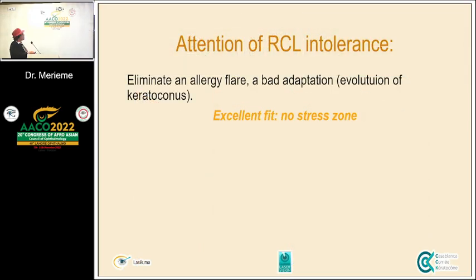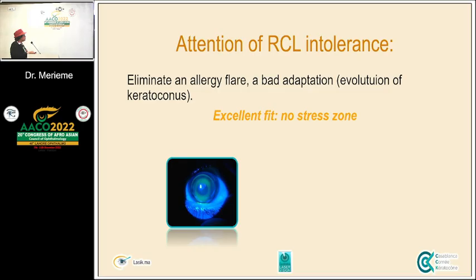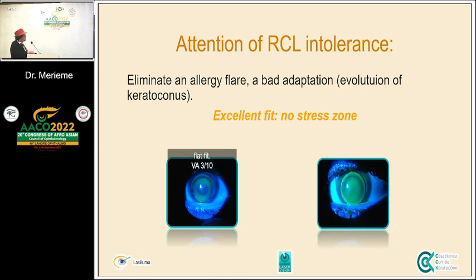We must be careful with the complications of contact lenses. We must eliminate an allergy flare and a bad adaptation. So we must have excellent fit and no stress zone. Like this child who had a flat fitting of his contact lenses, we just did a new fitting, and the lens is tolerated and the visual acuity rises.